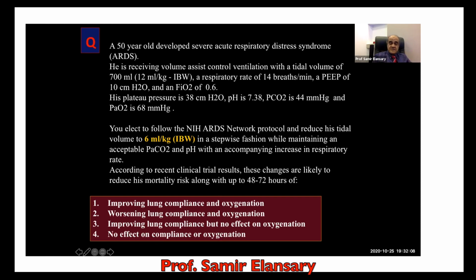If you follow this, as we see here, previously the patient on high ventilatory state may be subjected to barotrauma and so on. And the ABG, reflected ABG, accepted to some extent, and we are happy with its value. But if we attach it to ARDS network, we have to decrease the tidal volume, and so the patient will be hypercapnic, will be more acidotic, will be hypoxic, and so on. Which one do you prefer? The previous one or the new adjustment on your ventilator? And which one will lead to these items? I think it will worsen the lung compliance and oxygenation.